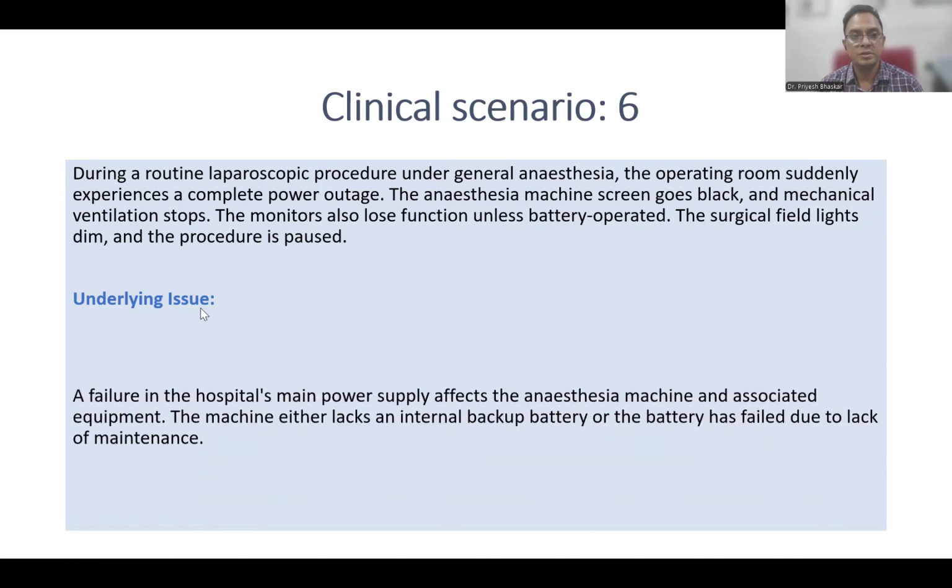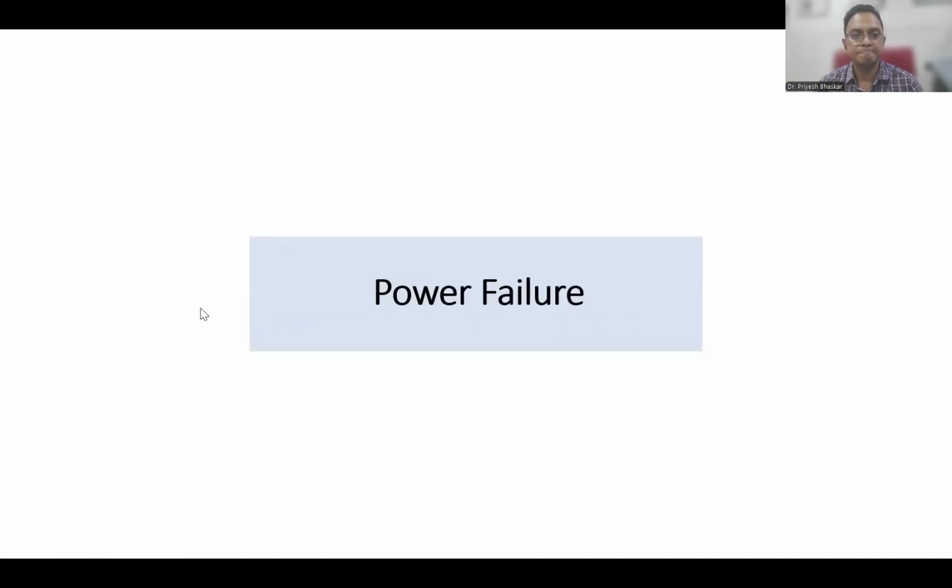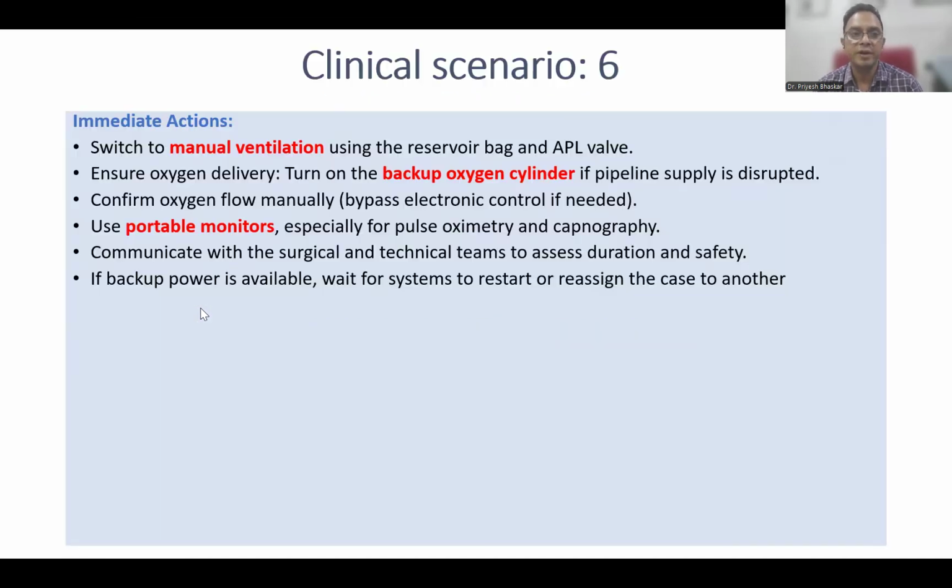So causes: a failure in the hospital's main power supply affects the anesthesia machine and associated equipment. The machine either lacks an internal backup battery or the battery has failed due to lack of maintenance. So it was a case of power failure.